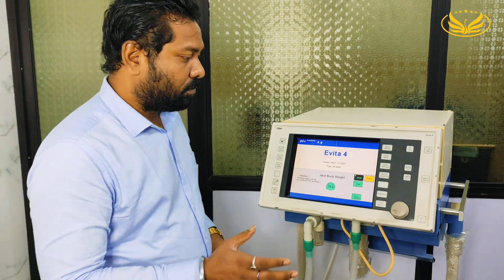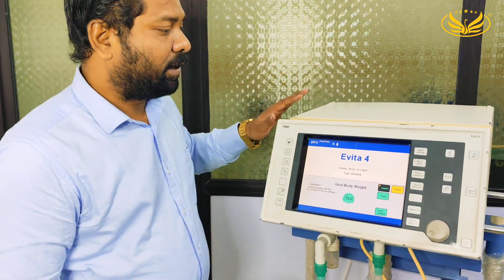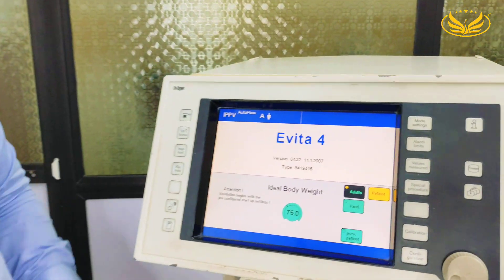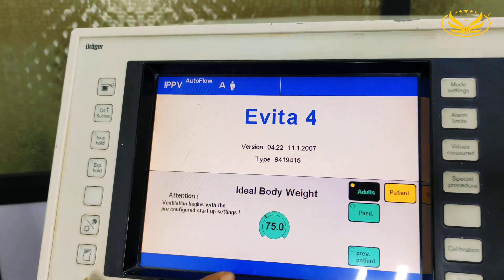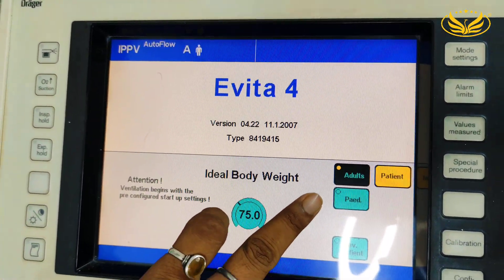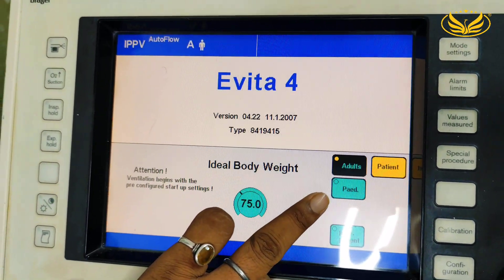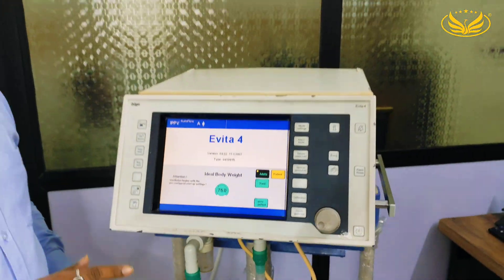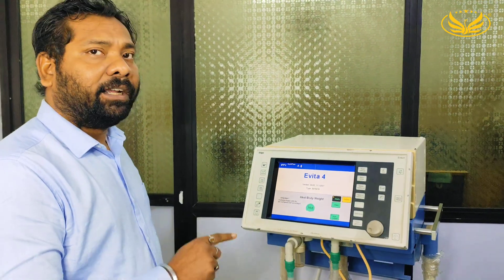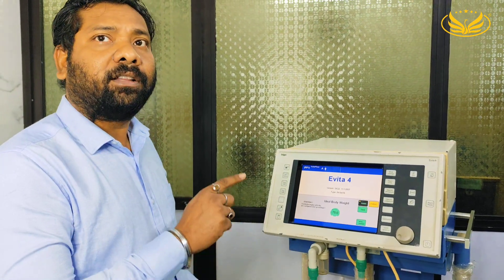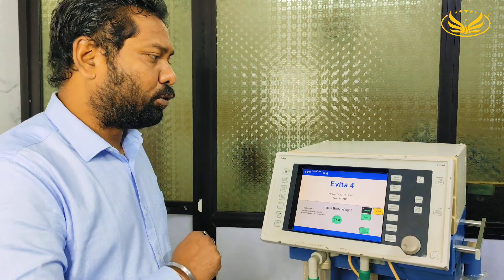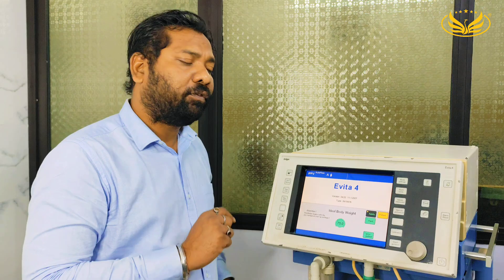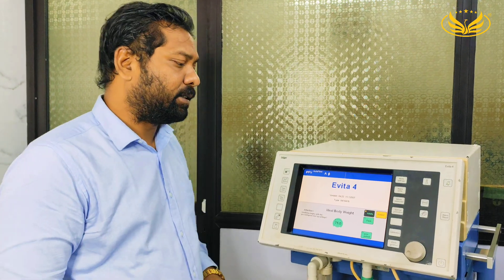This ventilator supports patient types of adults and pediatrics. In this ventilator we also have the option to integrate neonatal mode, where we can use that mode for treatment of newborn babies.